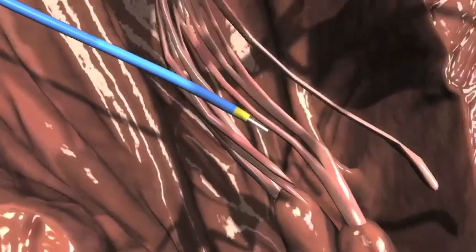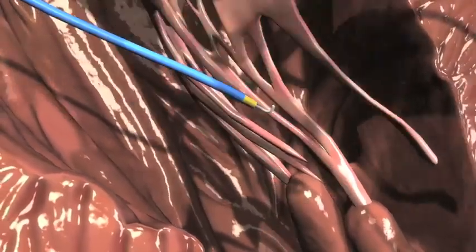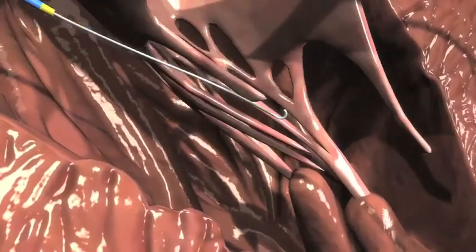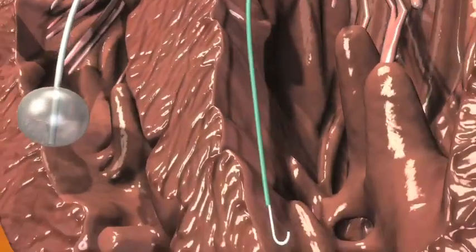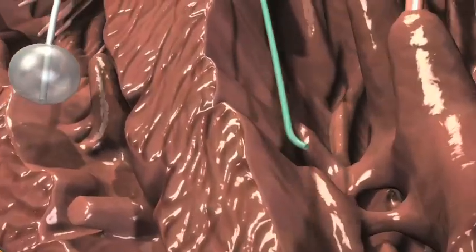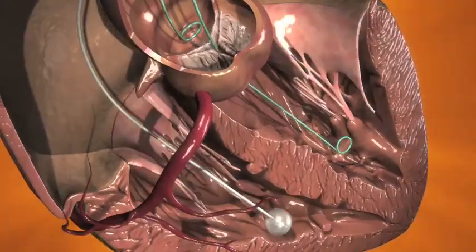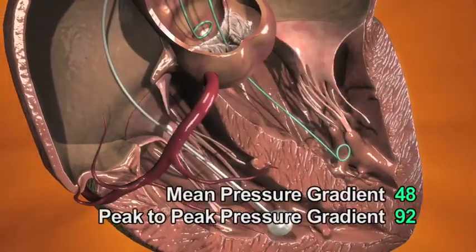Switch the straight tip wire for an exchange length 035 J-tip guide wire. Exchange angiographic catheter for a 6 French pigtail catheter. Remove the guide wire and connect the catheter to the transducer. Using both catheters, record the aortic pressure gradient.